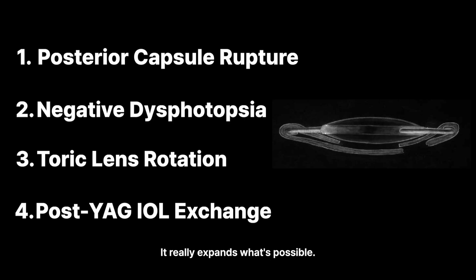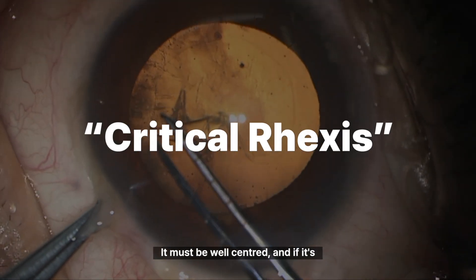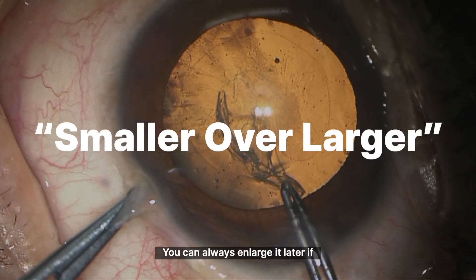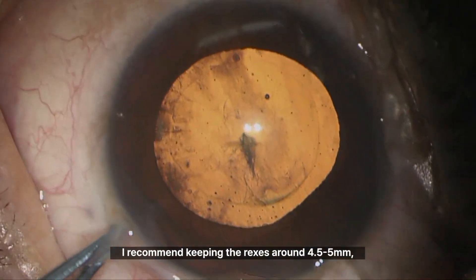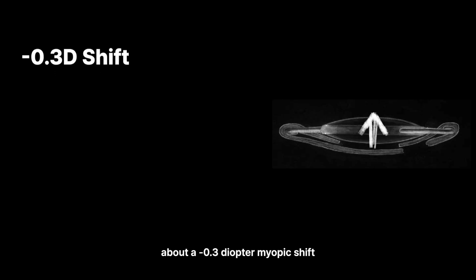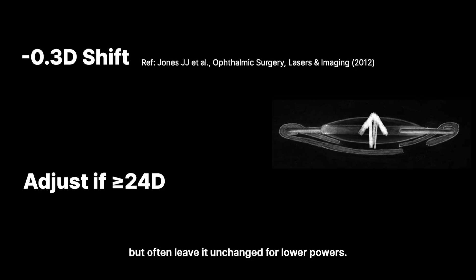What do you need to know about ROC? First, the capsulorhexis is critical — it must be well-centred, and if it's larger than 5mm, ROC becomes difficult. Smaller is actually better; you can always enlarge it later if needed. In cataract surgery, especially with multifocals, I recommend keeping the rhexis around 4.5 to 5mm, centred as precisely as possible. Second, the effective lens position shifts slightly forward, so the lens power calculation needs to account for that. Studies vary, but typically you see about a minus 0.3 diopter myopic shift compared to in-the-bag placement. Many surgeons adjust for this when the IOL power is 24 diopters or higher, but often leave it unchanged for lower powers.